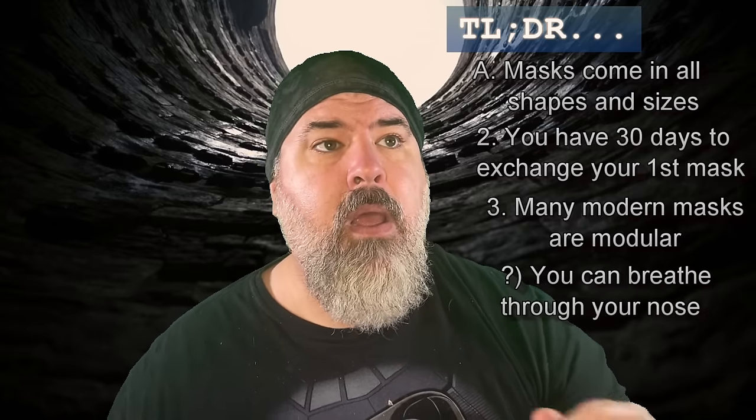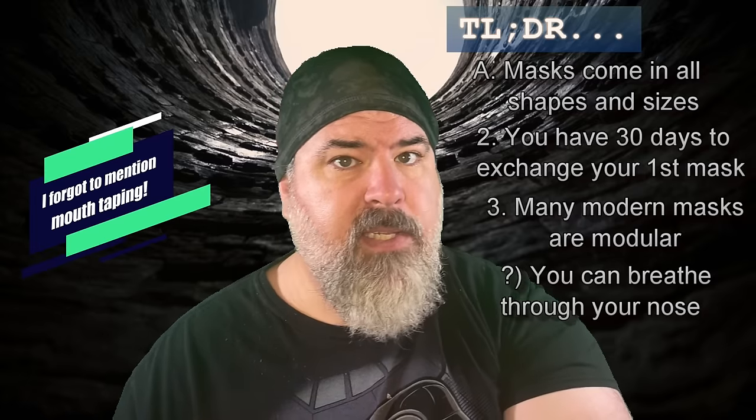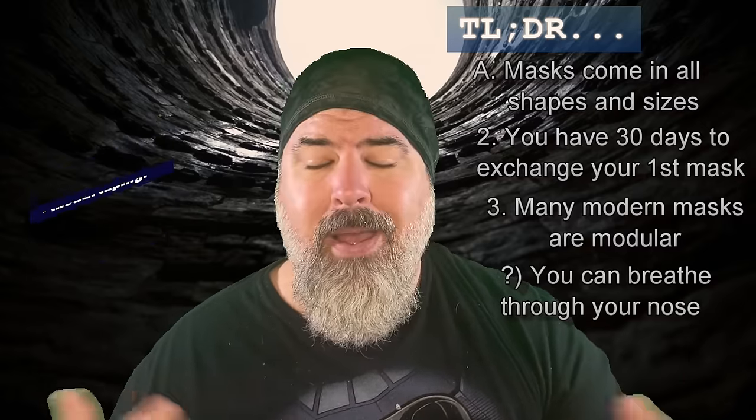So next thing, find a technique that works for you to keep your mouth closed. Maybe it's a boil and bite mouth guard. Maybe it's a soft cervical collar. Maybe it's a chin strap. Maybe, like worked for me, it's mewing. I don't know. But don't let anybody tell you this is the only way that works. As has been demonstrated in my family, what works for one person does not work for the other. Find the right solution for you.